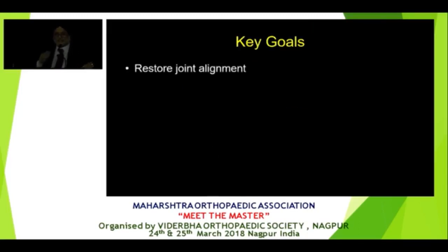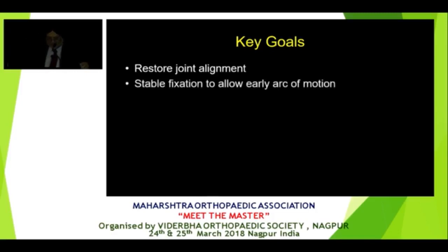As with any fracture, especially in the hand, when you have an articular fracture, the most important thing is to get alignment. And we saw that with the distal radius, right? You saw in the last case, great job getting the lunate back. Once you get the carpus aligned to the radius, the patient will do well. A little bit of articular step-off doesn't matter too much because it's a non-weight-bearing joint. So the goal is you get it aligned and then you get it moving.